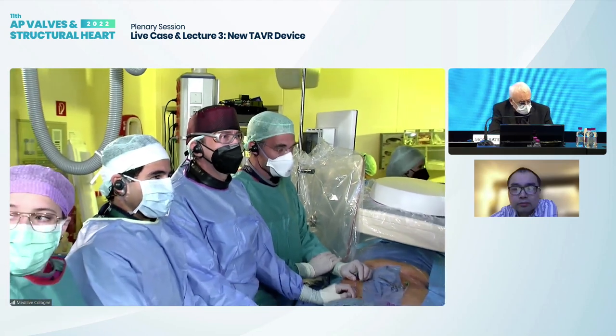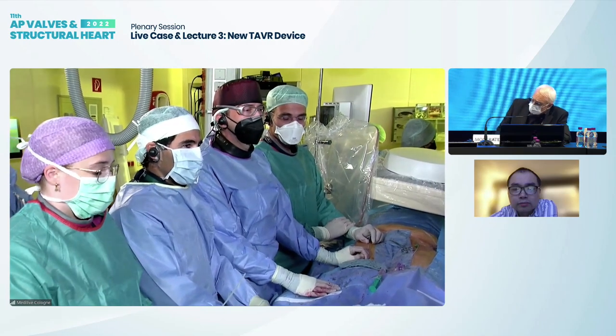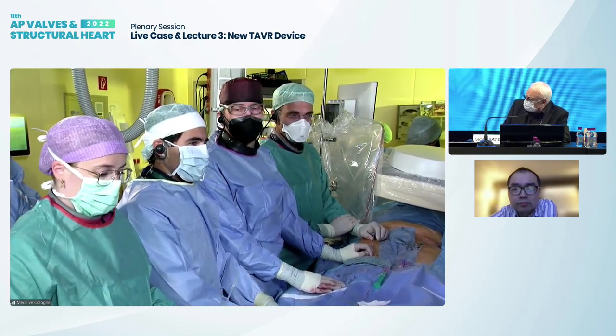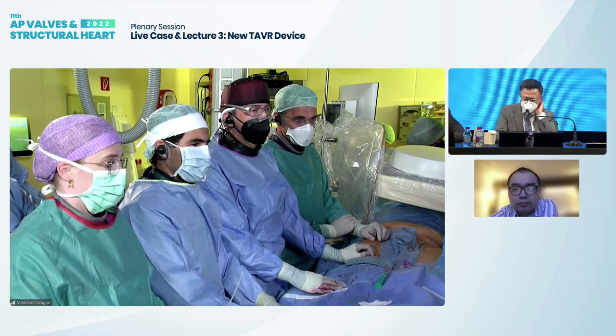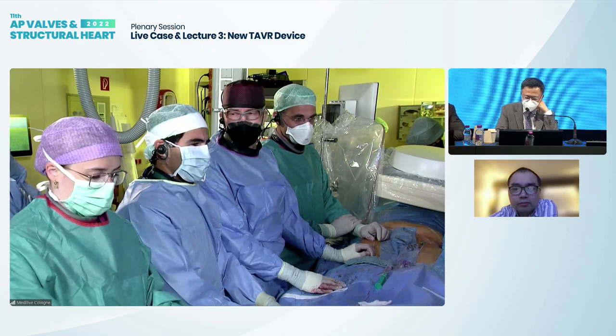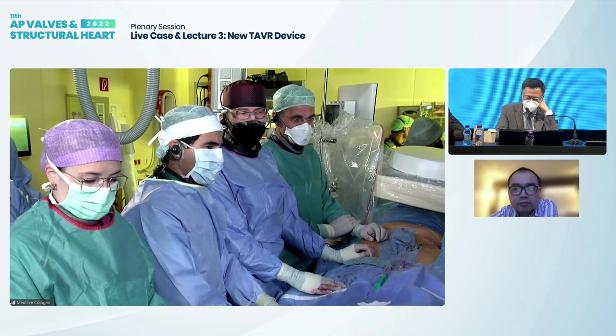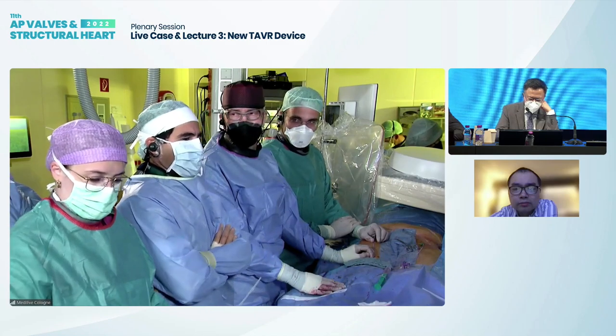And next to Dr. Kim, what do you think about the cases? Any comments from the panel? Alan? Can I ask Kim a question? What kind of aortic valve reconstruction did she have before? Is it a resuspension of the aortic valve that was diseased? Can you tell us a little bit more? Aorta surgery as well? Tavi, would you like to comment?